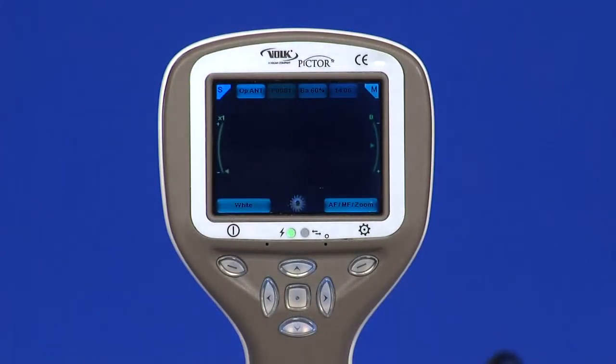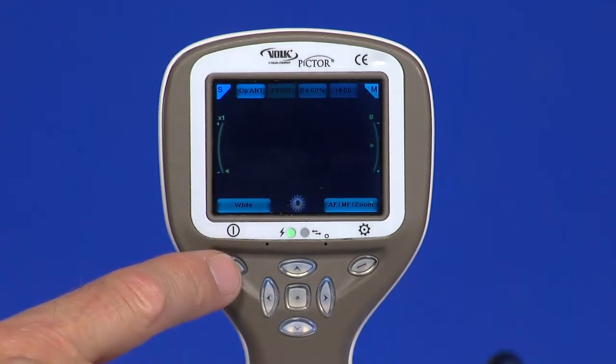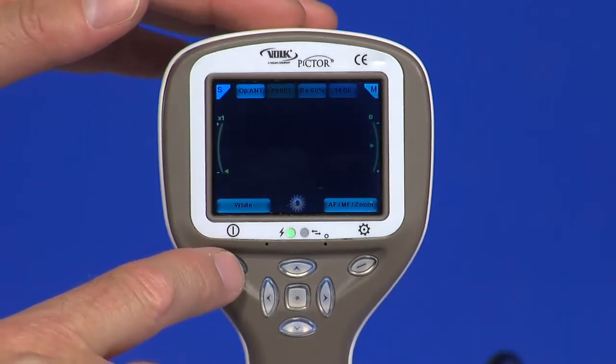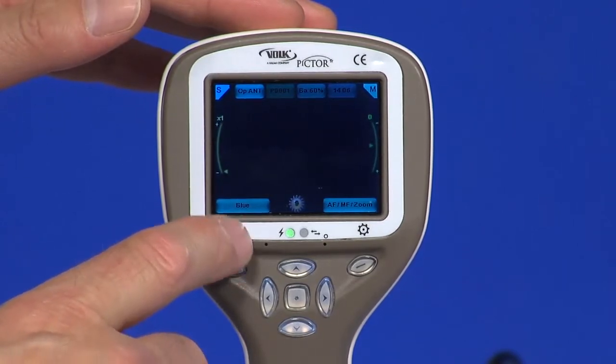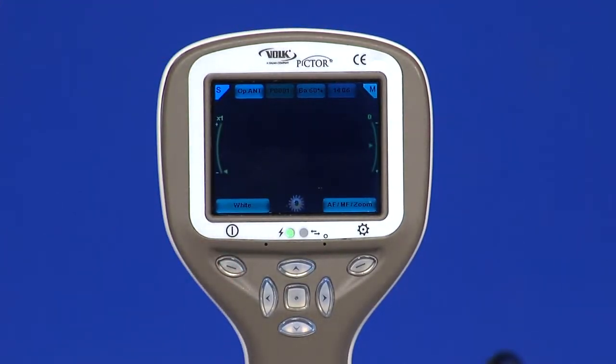Let us quickly run through the screen options when the anterior module is attached. There are two functions for the left soft key: choose between white and blue illumination. Blue light can be used with fluorescein applied on the eye to reveal any cuts or defects. The camera is powered on and off by pressing the left soft key for longer than two seconds.